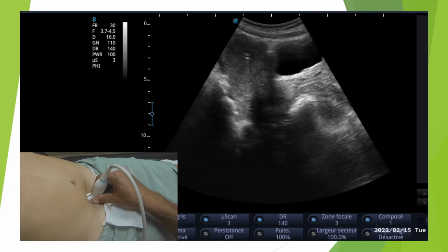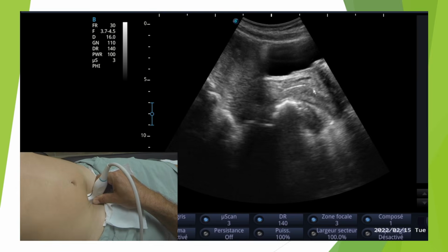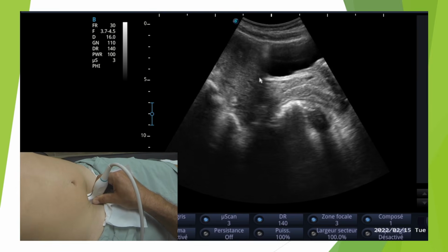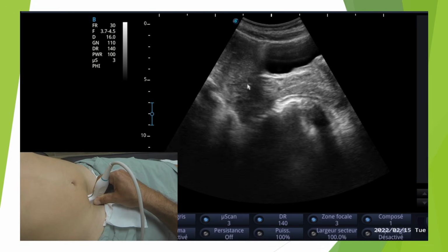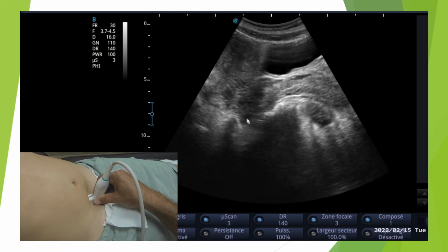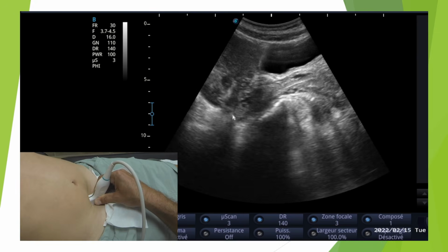You'll locate your bladder, and just behind the bladder, you'll find your vagina, the cavity. Here, usually with a lot of artifacts, a pretty artifacted image, the cervix is located here. Let me remind you that behind the cervix, you have the pouch of Douglas, and that's where you'll look for any fluid collection, right here.